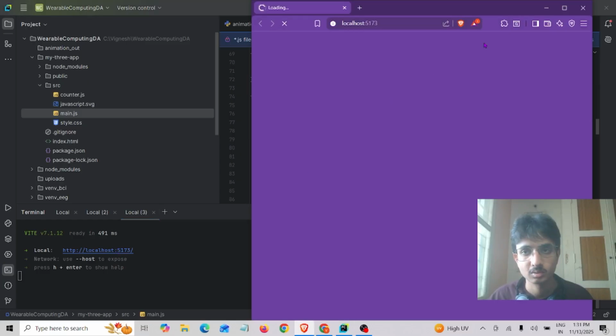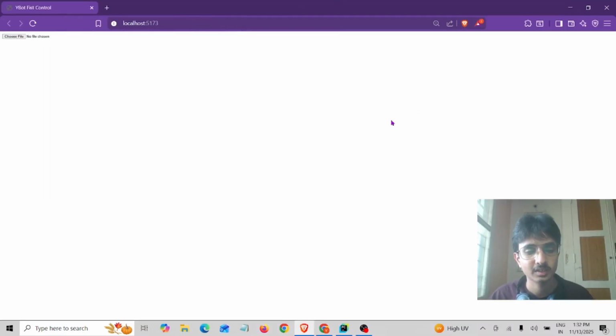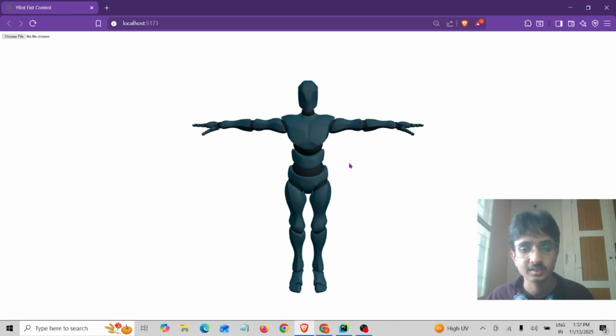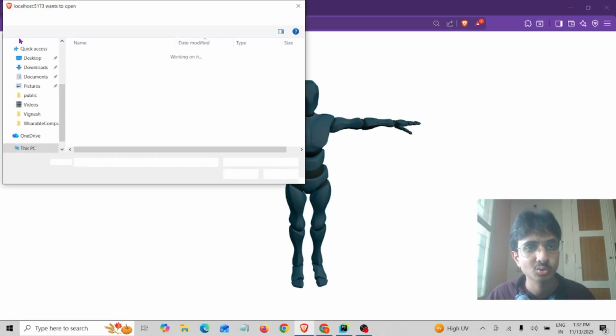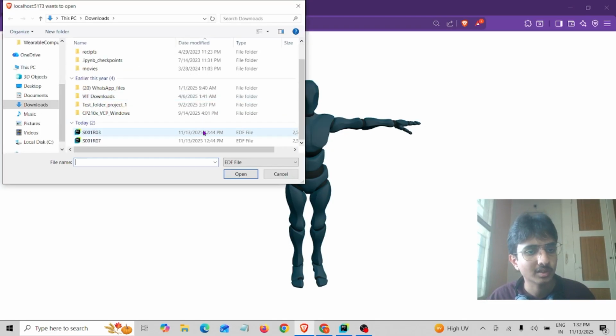So okay, now we can clearly see the robot, the Y-bot as we say, on the screen, and we can see a small option to choose a file to upload, and here we can choose any file. I have downloaded two files, one associated with the left hand and one with the right hand. So let me upload the left hand imagery EDF file. This was downloaded from the same dataset that I have shown you earlier.